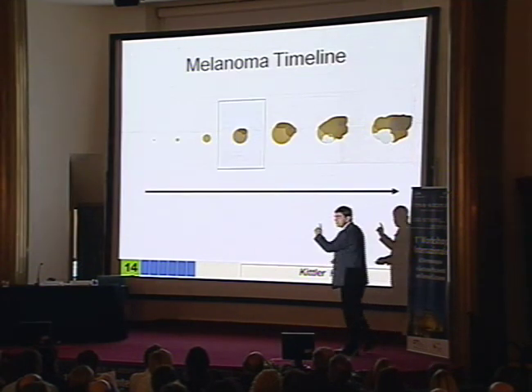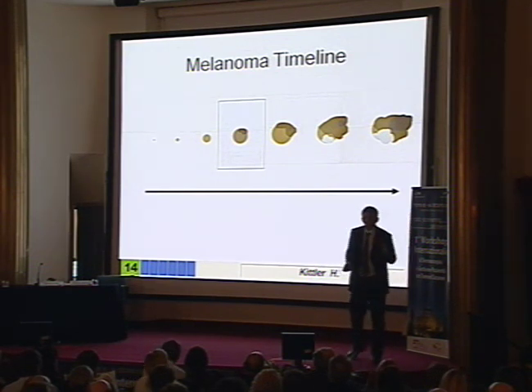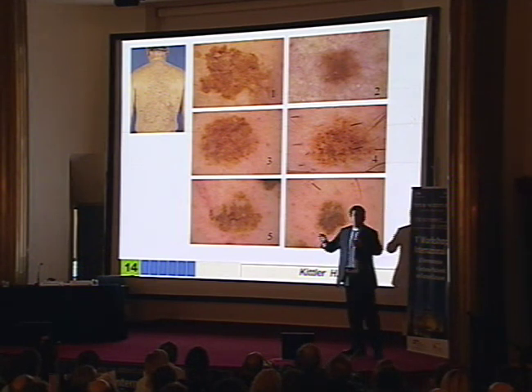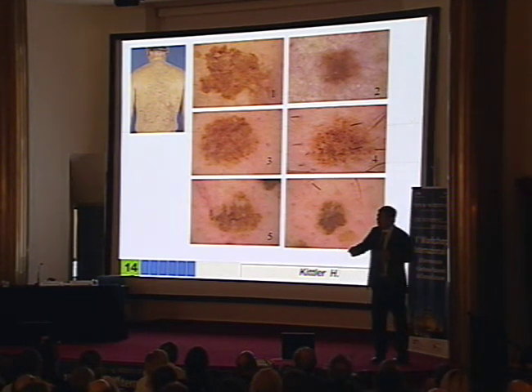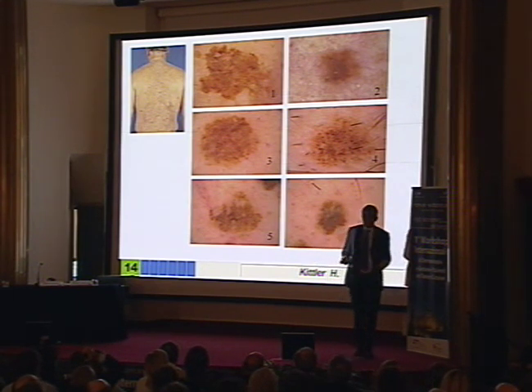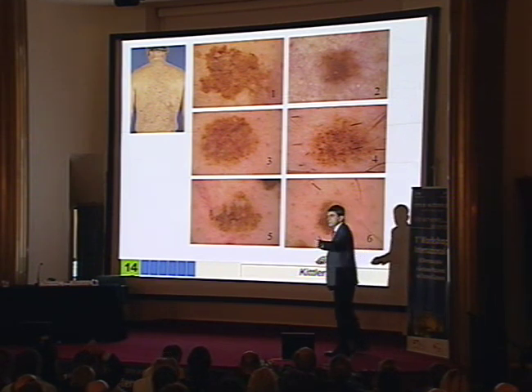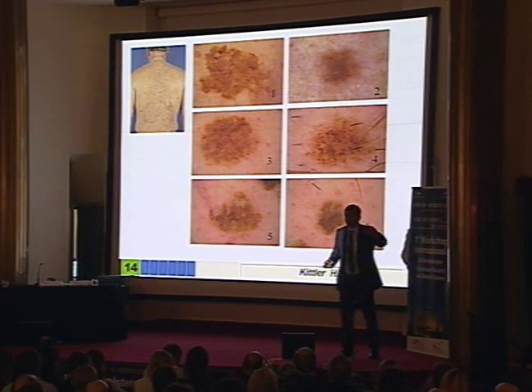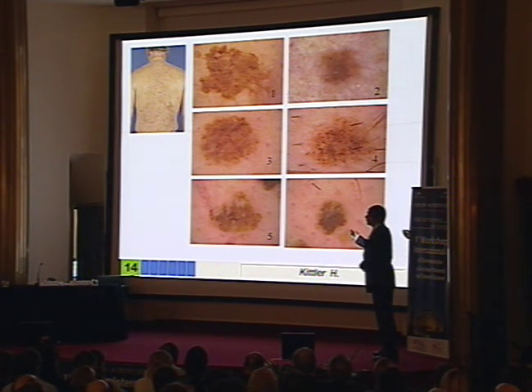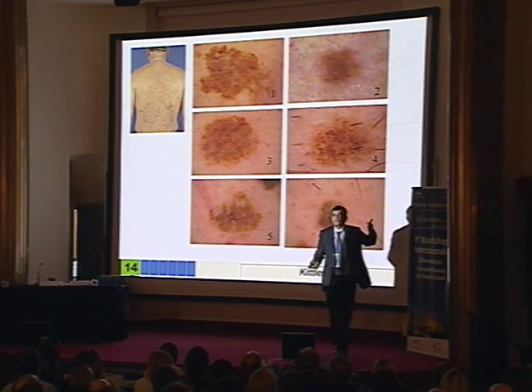But sometimes the situation, especially when we go back in the history, is not so easy. For example, in this patient. He has multiple moles, and he probably has one melanoma. And the question is now, which one is the melanoma? Which lesion to look after with the dermoscope? Which lesion to excise? And if no lesion should be excised, which lesion to monitor? Which of the 6 lesions would you excise? Every lesion? Only 1? 2?